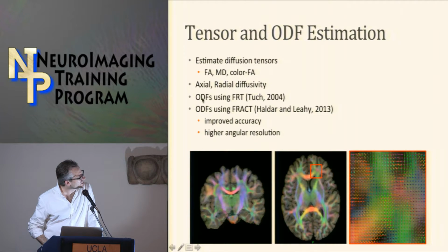We also compute ODFs using the FRT approach, which is a traditional approach, as well as the FRACT, which is a method that Justin Haldar and Richard Leahy, who are our collaborators on the project, developed, which provides improved accuracy and better angular resolution compared to the FRT.